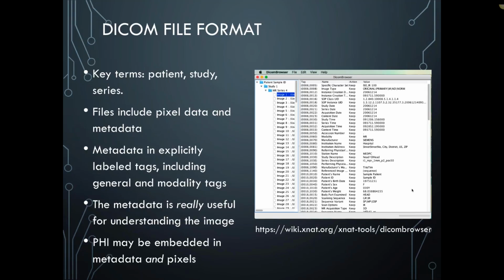So those of us on the research side often call these things, the patient we might say is a subject or a participant. Study we might call a session or just a scan. And then the series, sometimes we call those just the image, or sometimes those the scan. So on the research side, there's a lot of kind of mixed and overloaded use of these terms, but they're pretty strictly used within the DICOM side. There's a whole lot of metadata included.